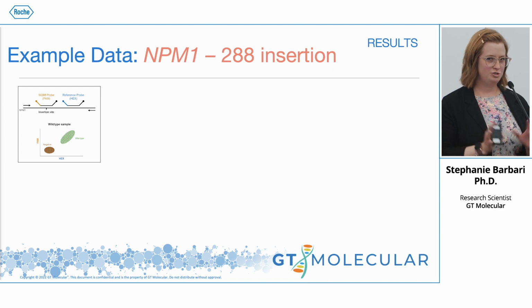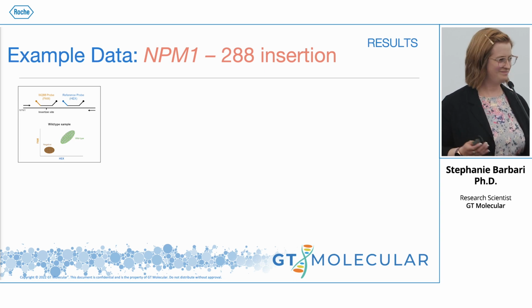So now that I've told you about the utility of this assay, let's show you the data. And you did a great job explaining the Roche and how great it looks. So this is our NPM1 assay.